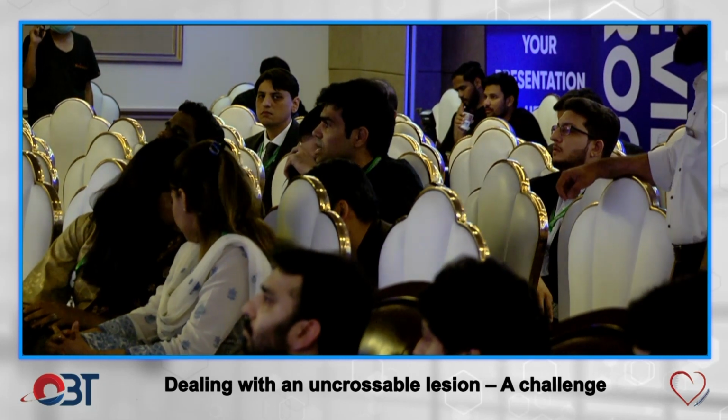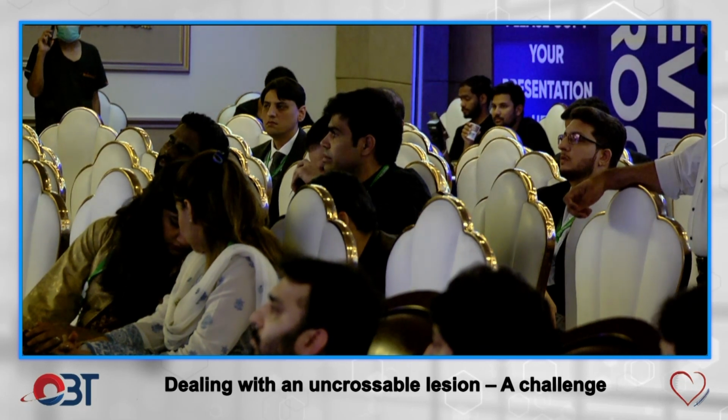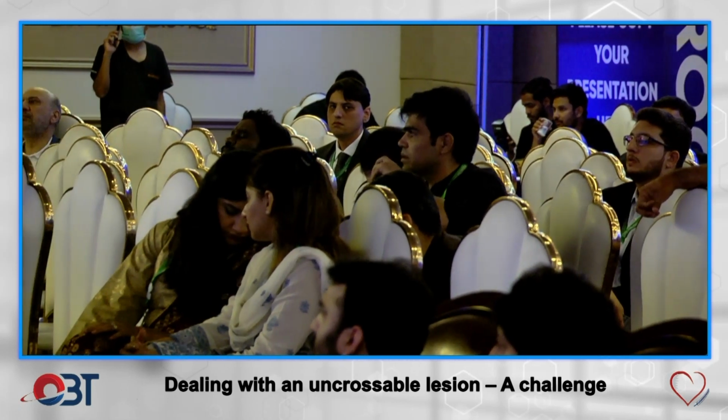Was it Gold, LP, which one? Which Turnpike did you use? Actually, Gold is the best for calcified vessels. So, it was a simple Turnpike.